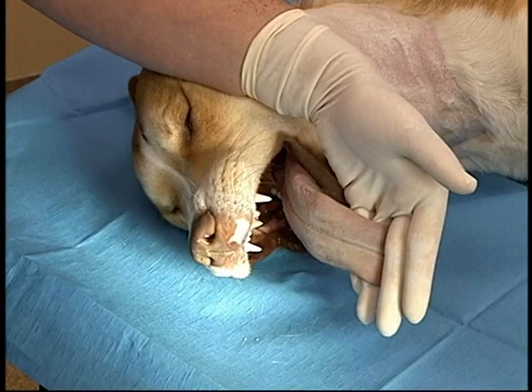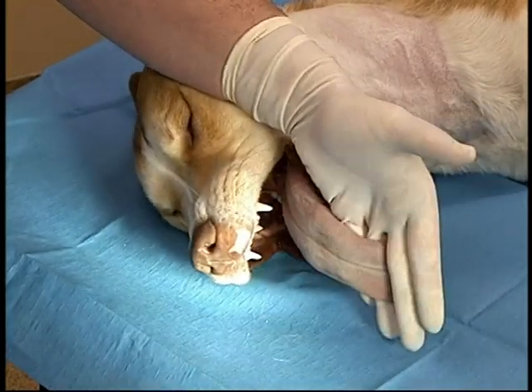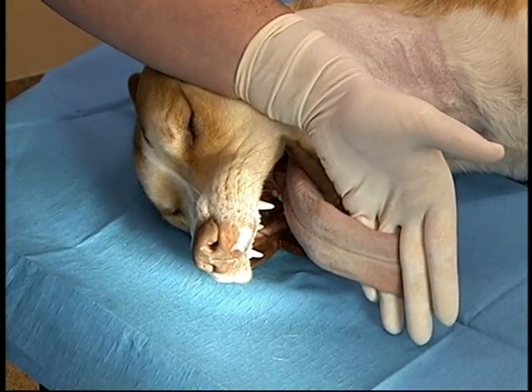Lateral intubation can be performed by one individual. In patients with very low flow states, acutely elevating their head to intubate may cause blood to drain from the head and cause a cardiac arrest.